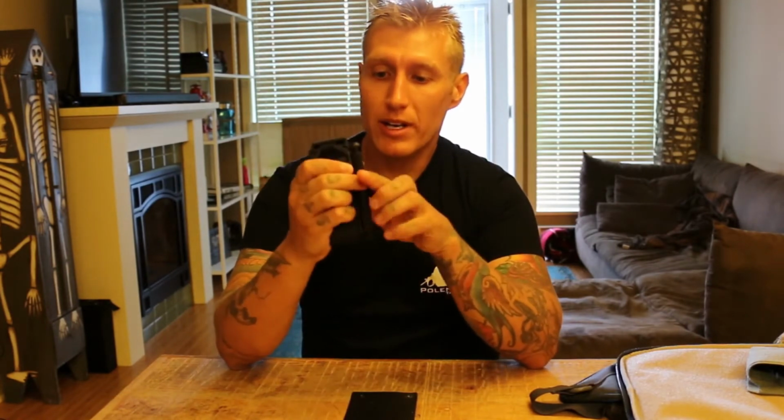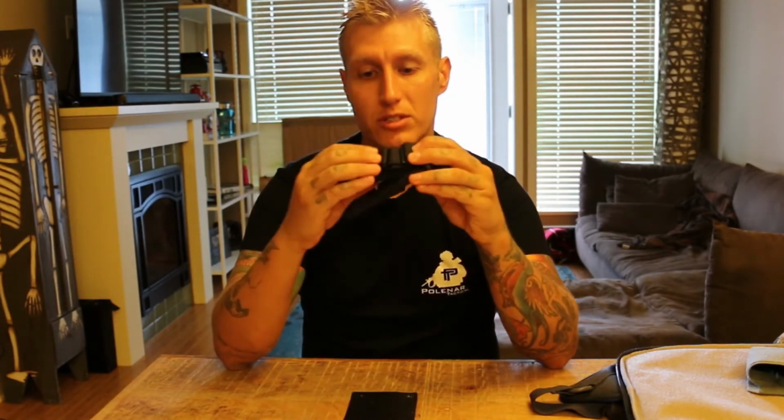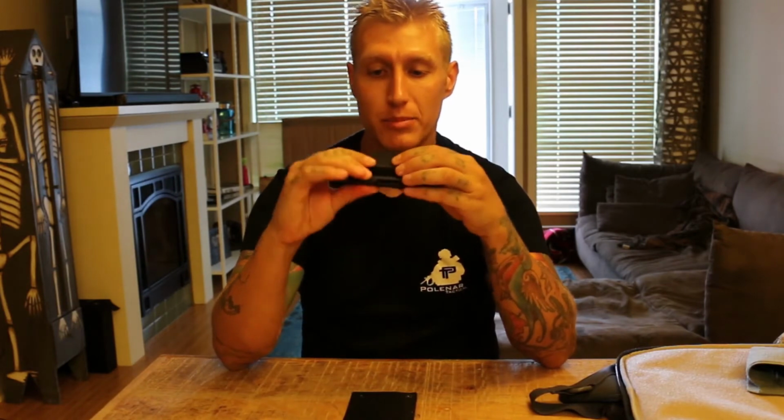When I fold things this way, I found that it gives me very few folds. There's no spots that are any wider than they need to be. As you can see, all the folding on this side here is just as thick or thinner than the metal part on this side here. I found that this method gave me the most compact method for folding up the soft T wide. So it's not the exact same as ITS Tactical's flat fold method. This way you don't need any rulers, you don't need to measure. You're basically just using the lengths and measurements based off of the widest part of the tourniquet here.